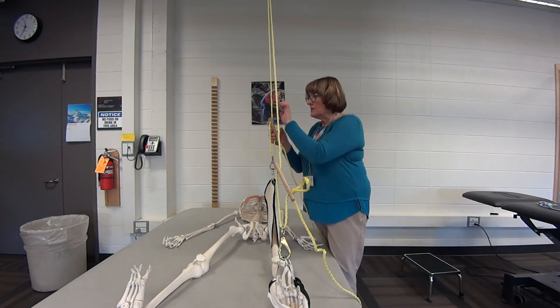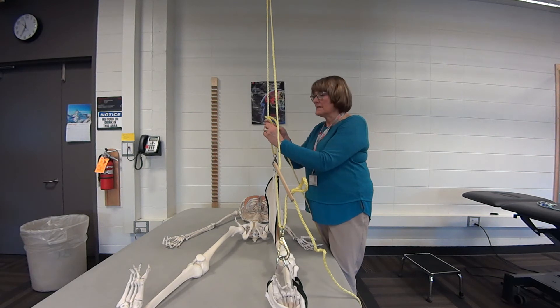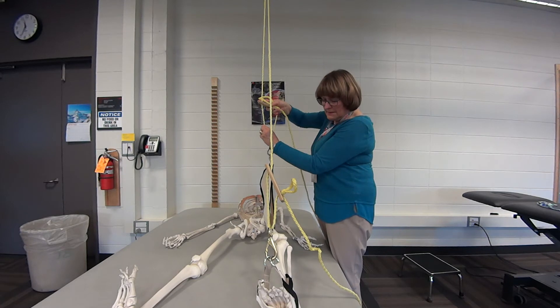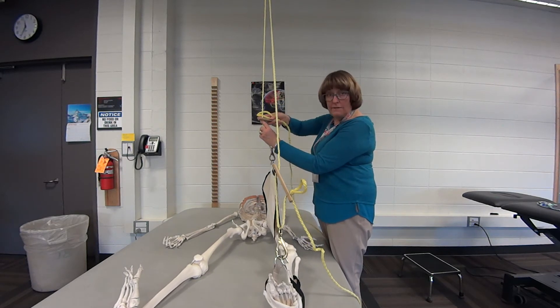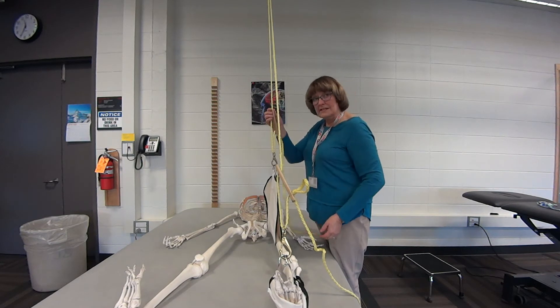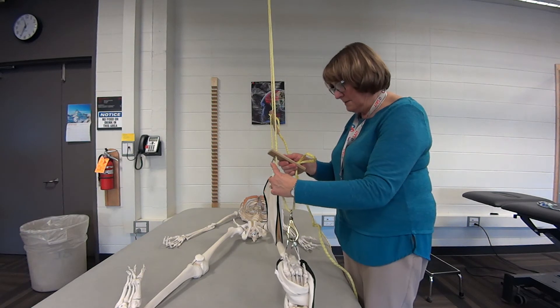What you then want to do is move the most proximal sling over the heaviest area, flatten it out, and lift up. You're taking them off the bed and then going like this so it locks it. Then move to the foot and do the same thing.